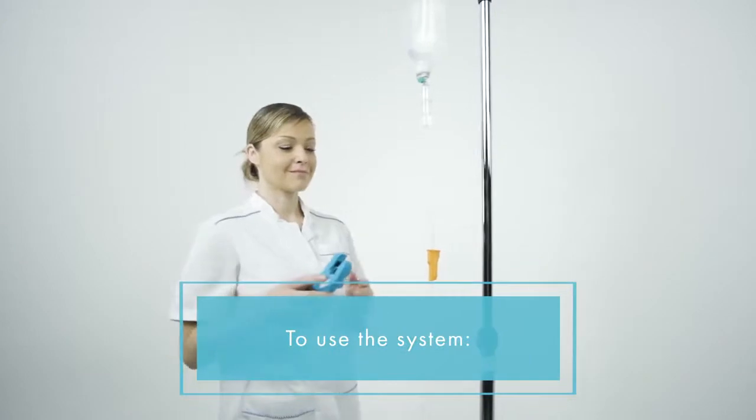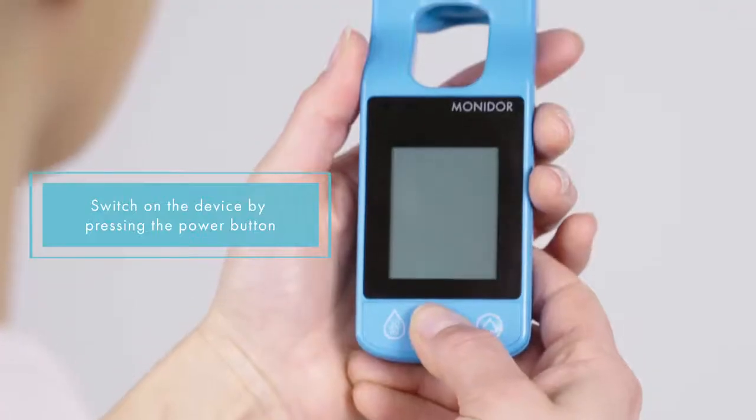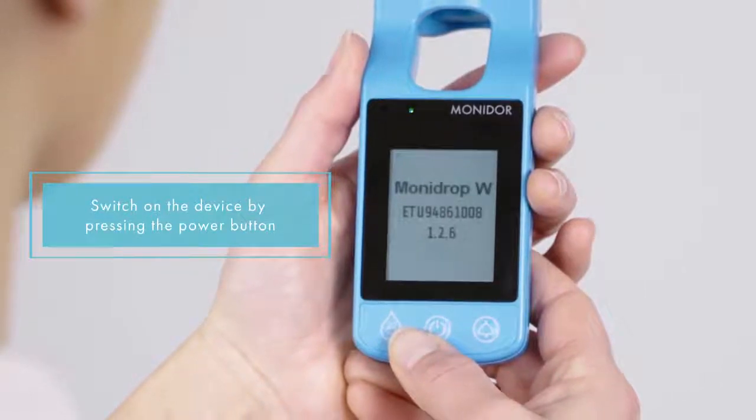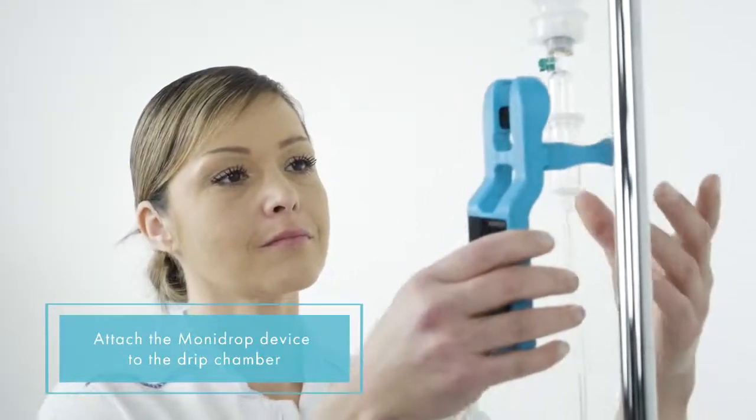To use the system, switch on the device by pressing the power button. Attach the MoniDrop device to the drip chamber.